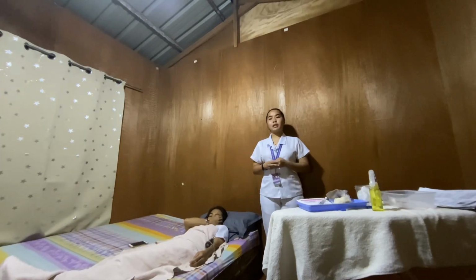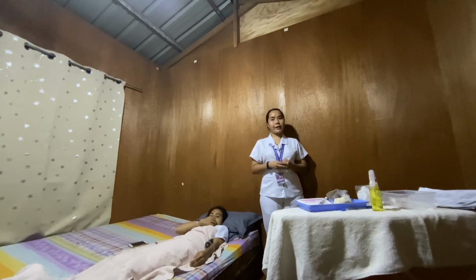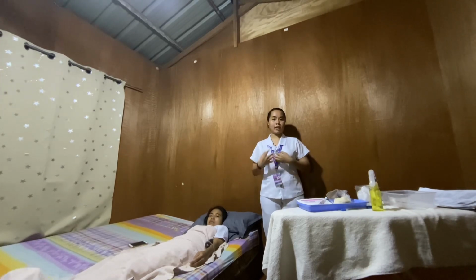Next, explain to the client that the medication will produce a small wheal, or sometimes it is called a bleb. The wheal is a small raised area like a blister, and the client will feel a slight prick as the needle enters the skin. This information can facilitate acceptance and compliance with therapy.